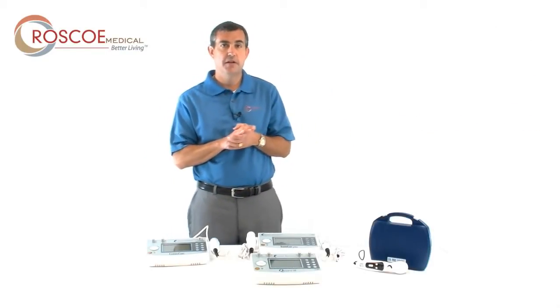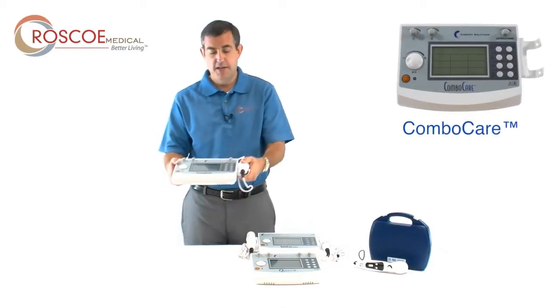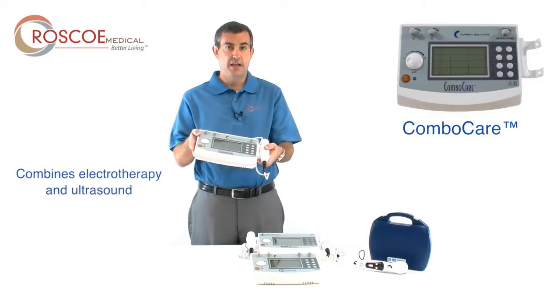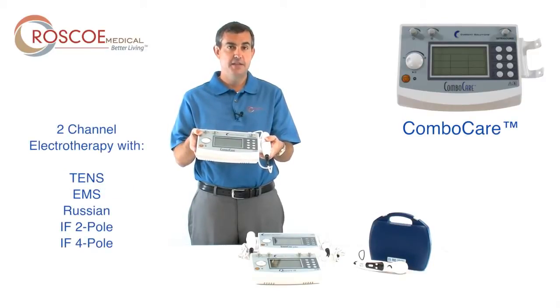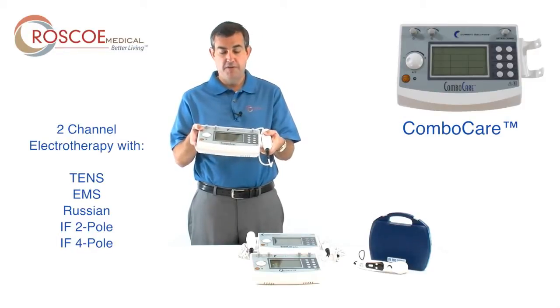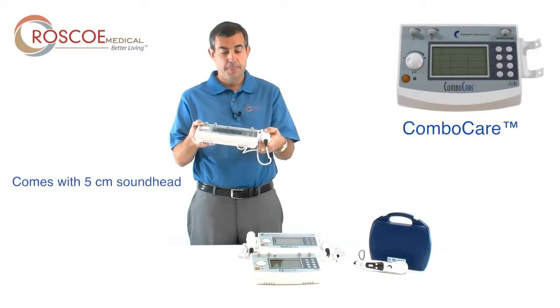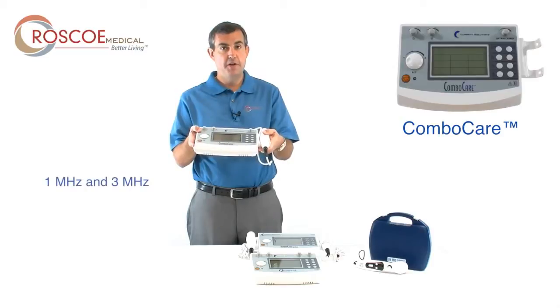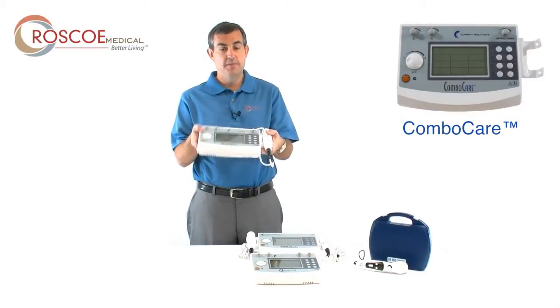The flagship of our clinical devices right now is the ComboCare. The ComboCare is exactly what it says — it combines electrotherapy and ultrasound. It comes with two-channel electrotherapy that has TENS, EMS, Russian, IF2 pole, and IF4 pole, all in one device, and comes with an ultrasound with a five-centimeter sound head. The ultrasound is one megahertz and three megahertz, and it all comes in a convenient package. You can use this at the clinic, but you can also take it to a customer or patient's home.